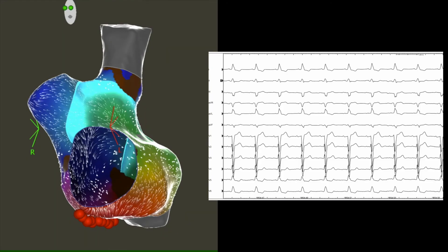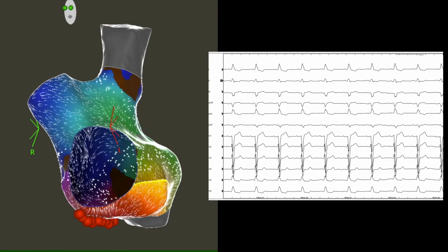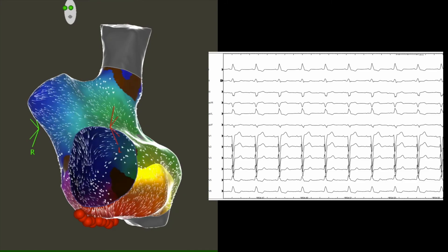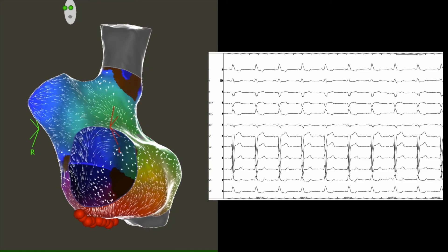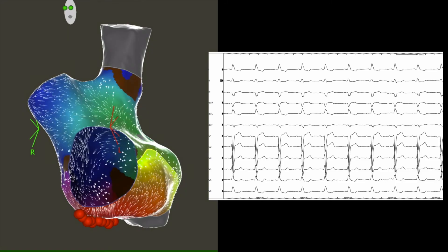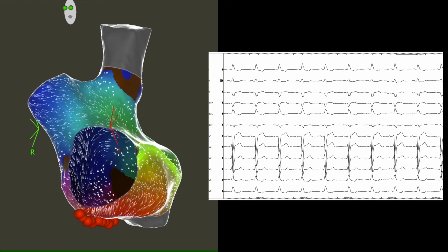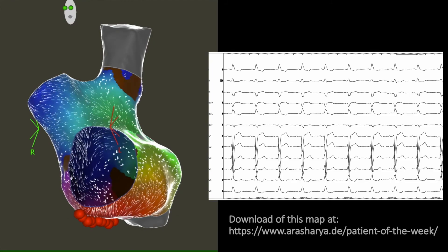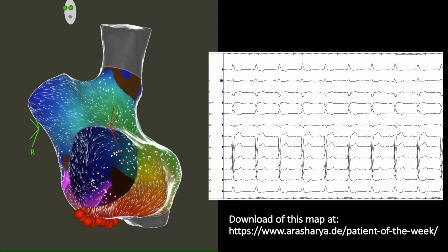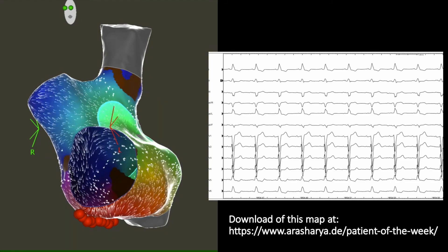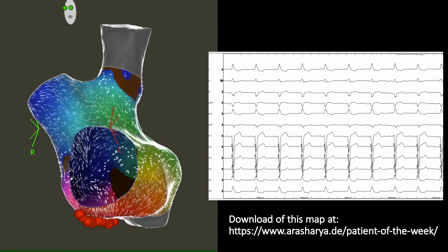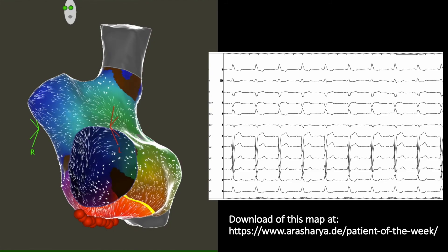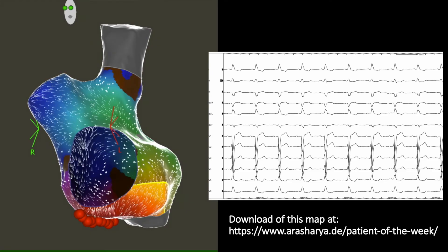Here we see the activation mapping using coherent mapping, which showed an isthmus-dependent, counterclockwise, peritricuspid atrial tachycardia. Ablation of the cavotricuspid isthmus successfully terminated the tachycardia.